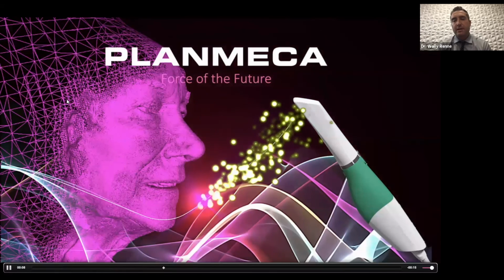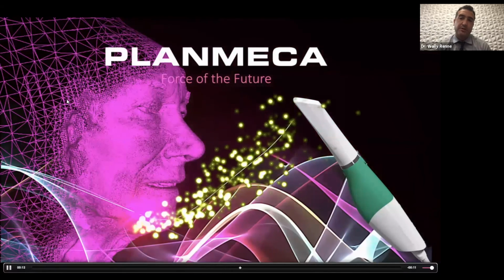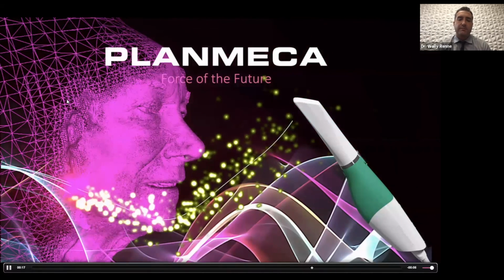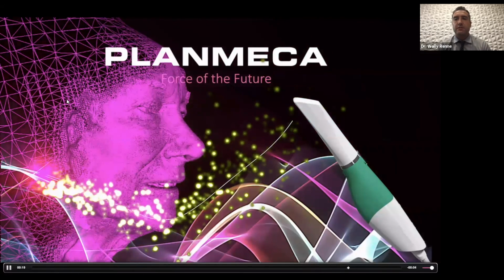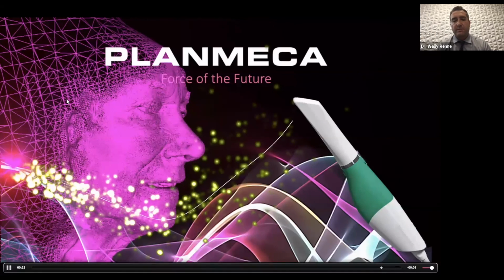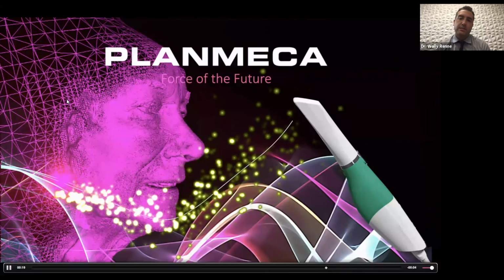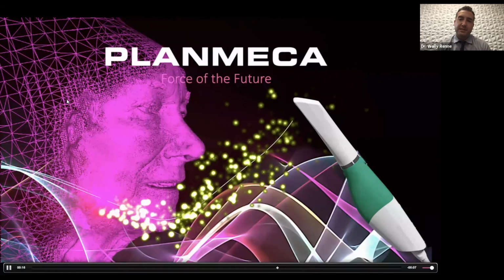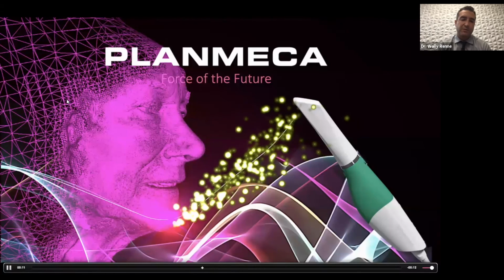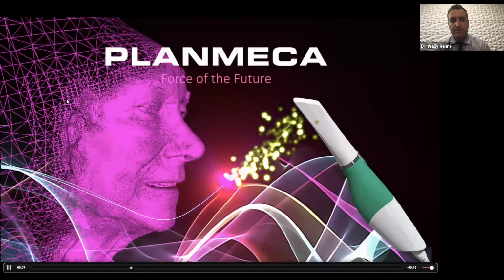And so I'm excited to share with you how I exactly go about using this software to treat patients. A little bit about myself, if you don't know, I am the Assistant Dean of Innovation and Digital Dentistry at the Medical University of South Carolina. I also am Assistant Director for the 2-year digital dentistry residency that we have, and it's an exciting residency. It's kind of the first of its kind, and we're super lucky to be able to treat patients using the very best technology on the planet.